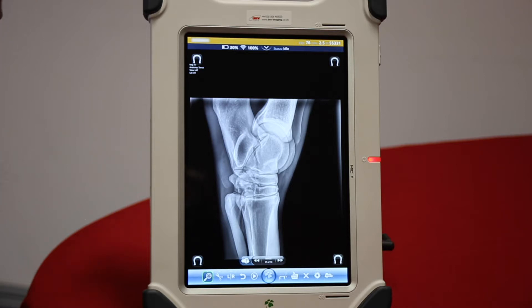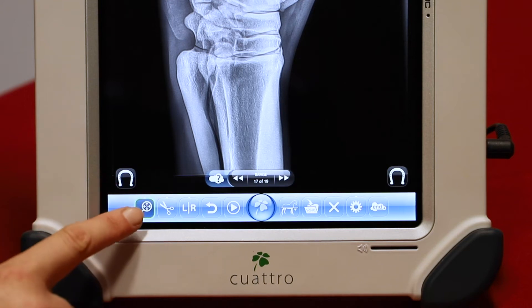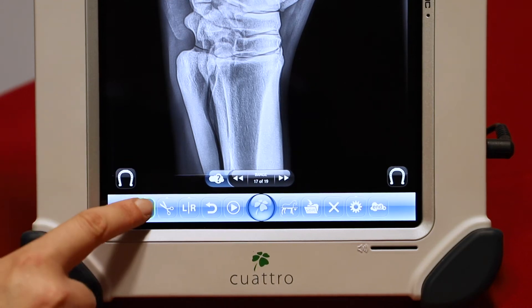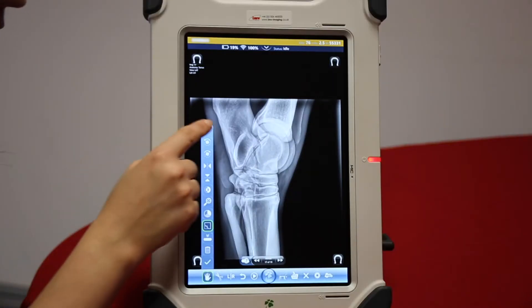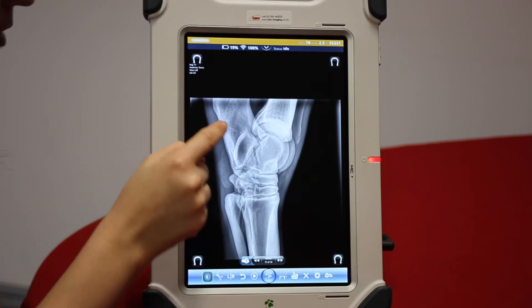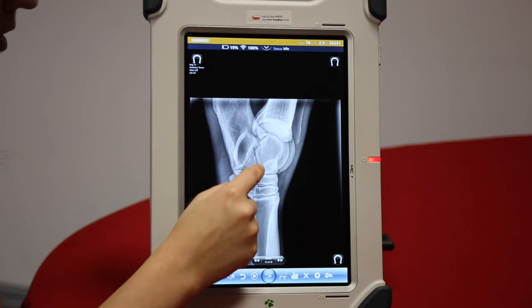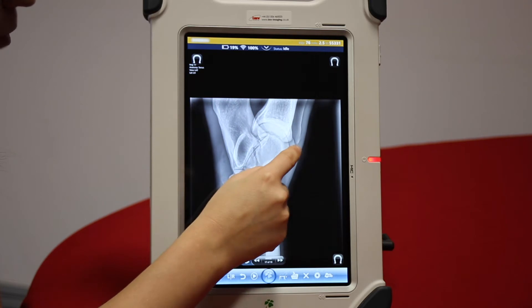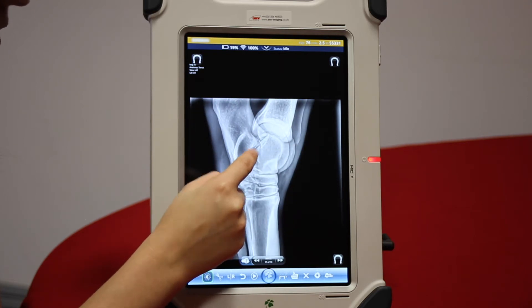Once you've taken your X-ray, there's lots of ways you can review and change your image. The bottom left function key takes us to a range of functions. Brightness and contrast is the first one — select that, then move your finger over the image to change brightness and contrast.